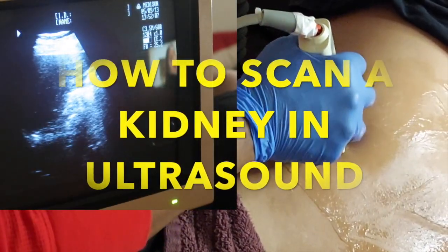Welcome back to another video. I'm just getting right into it. Let's go — how to scan a kidney.